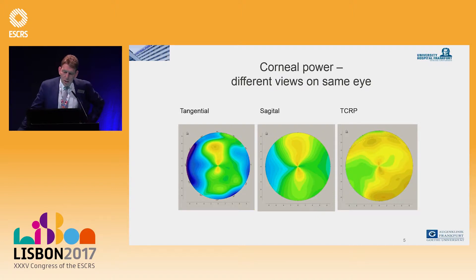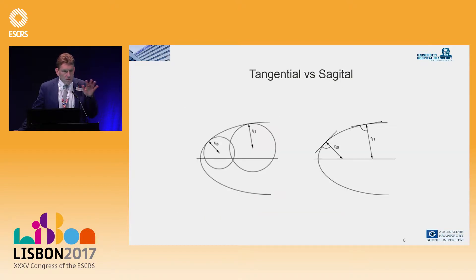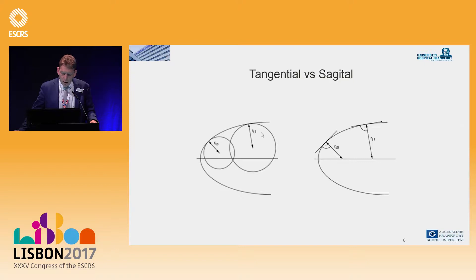Looking at corneal power — different views on the same eye. This is a tangential map taking the anterior curvature. This is a sagittal map looking at more points. Comparing tangential and sagittal maps: the tangential takes a tangent at each point to produce a picture for evaluation.